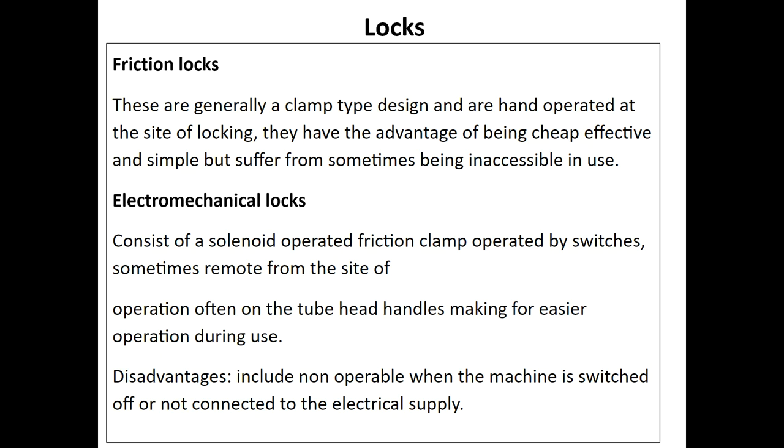Here's something that happened, but then they went back to the old way. They used to have remote control exposure switches. I may have told you about this before, right? You could have all sorts of fun with them, no cord. You wouldn't have Jodi Ann and I yell at you, don't snap our cord when you're too far back, because there'd be no cord. Of course, what would happen is they'd lose the exposure switch. That's like having your TV and not being able to change the channel. Worse, at least you could watch one channel, usually. So they tried that. I mean, it was kind of cool.